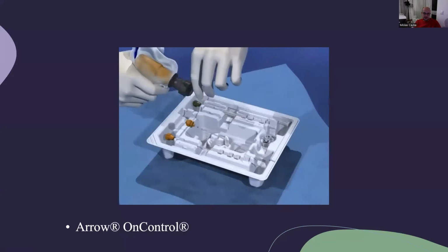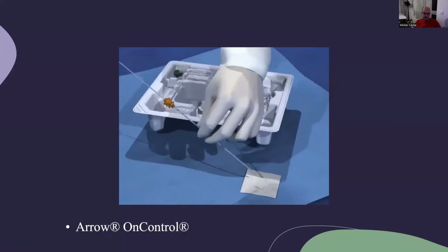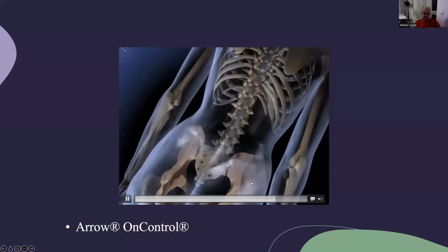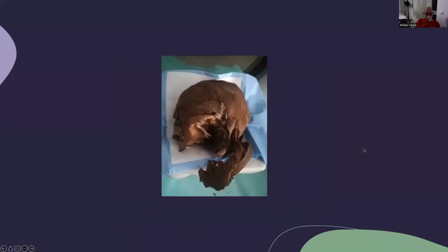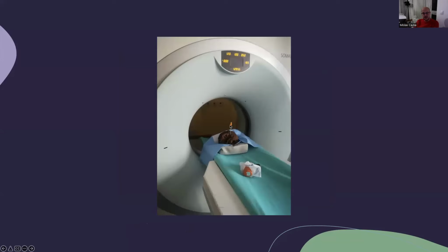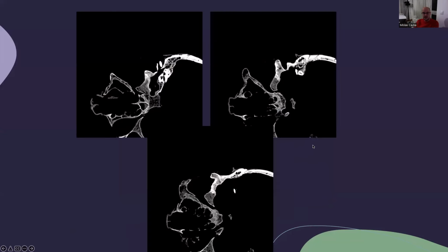And I will show you how it looks when we use it in, let's say, paleoradiological clinical settings. So this is a mummified head from the Zagreb Museum from Egyptian times as well. We wanted to minimize the damage by being sure from where we have taken the biopsy sample. In this case, we wanted to do C14, although maybe the sample was too small for the stable isotopic analysis that we wanted to do, but we got the C14 results.